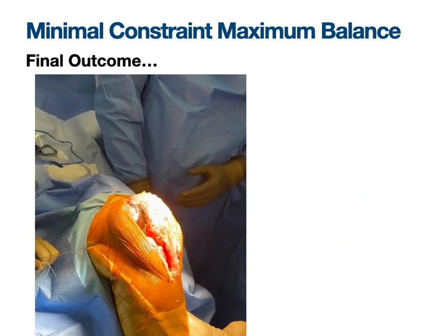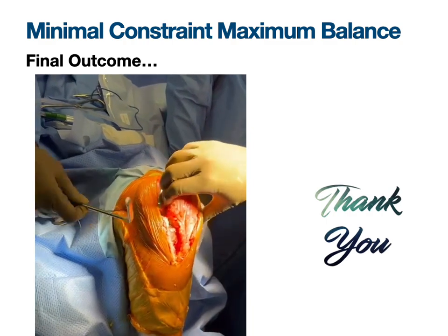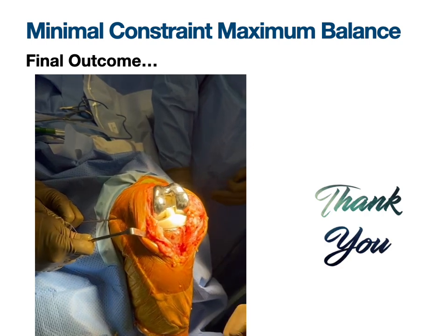So this is the final outcome of our patient. You can see that we are holding that PLC in the appropriate tension, and you will see that despite the rotational and anterior stress, there is a good amount of stability.